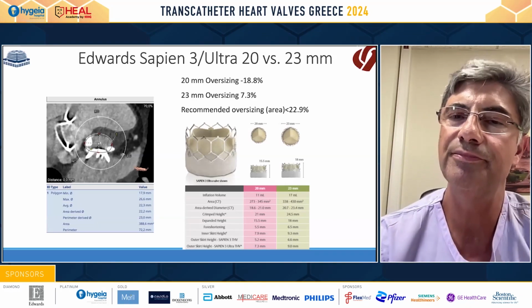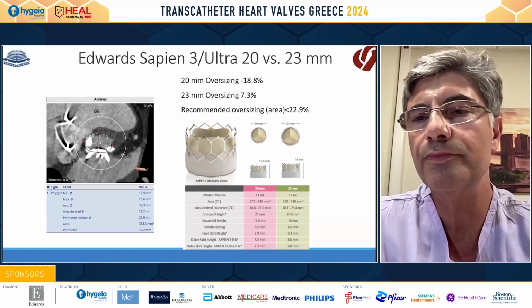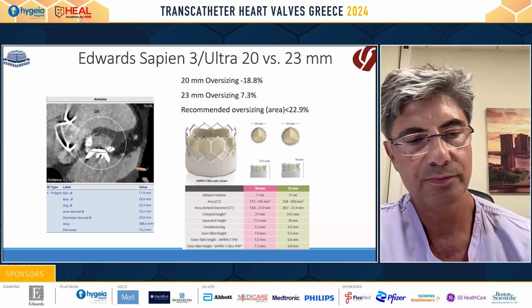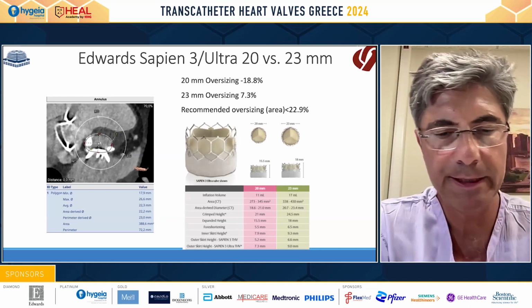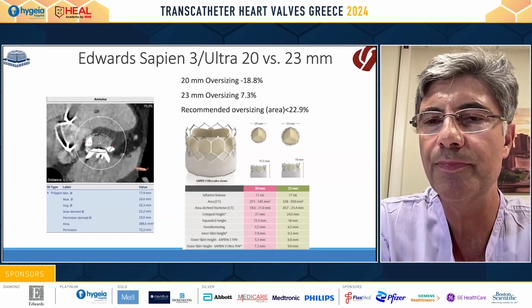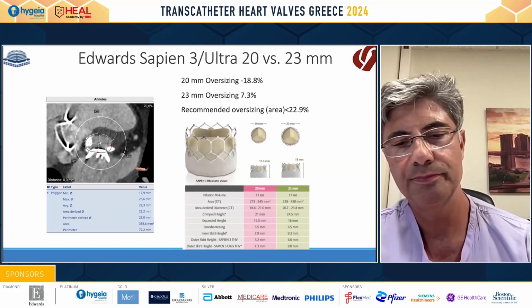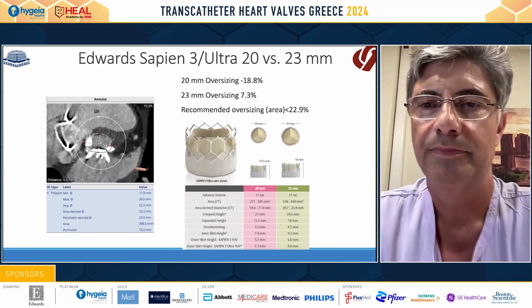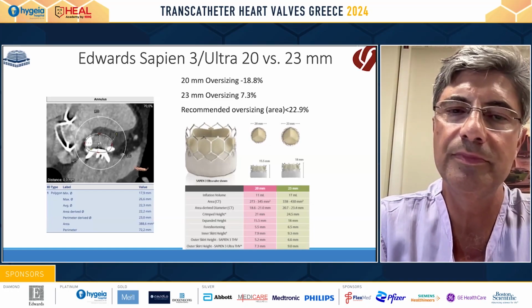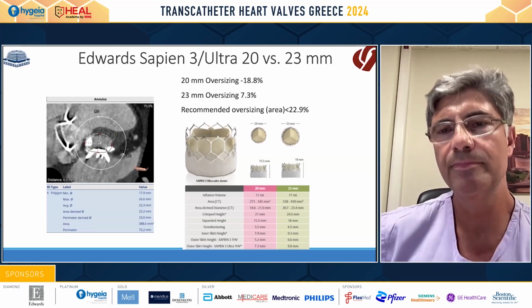So I think one of the most important advantages of the self-expanding valve is the fact that this is repositionable and resheathable. So you can remove the valve and position it in a better position, especially in this case where the aortic mitral distance is very small and the result is unpredictable with a balloon expandable valve, even in experienced hands. I think the FX will be the solution for this problem, the new technology of the Medtronic platform, because it's very stable and very predictable, and you can deploy the valve at the position you want. In this case it will be ideal with a good hemodynamic profile, and even easy access to the coronaries if you manage to have the commissural alignment.